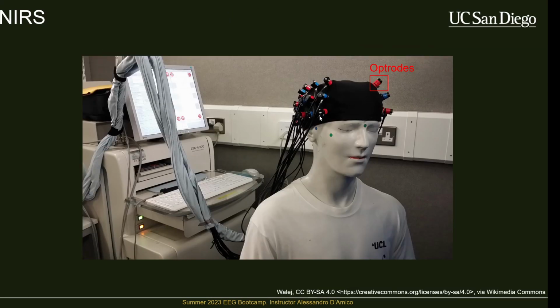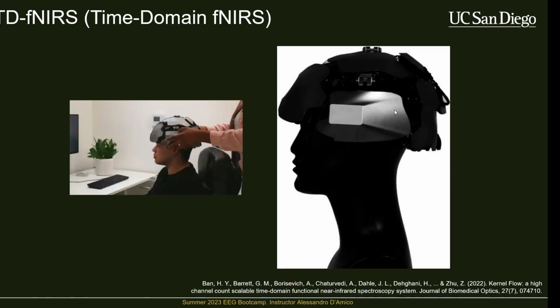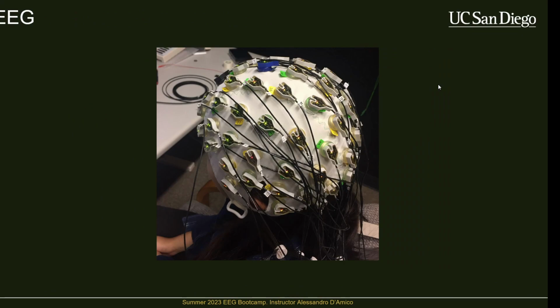Even this, which has a lot of plastic, it's still a cap. Anything that goes on your head, I'm calling a cap. Some people might call it a headset instead, like they might call this a headset instead of a cap. I'm just going to use the generic term cap for everything, just so that we know it's the thing that's going on somebody's head with the recording instrumentation on it.